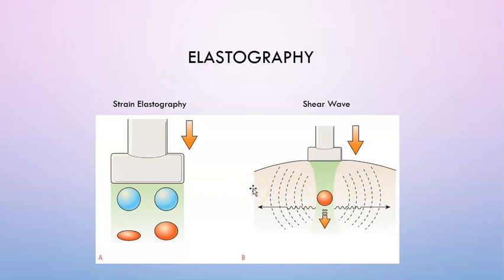Okay. Now, previously we've talked about how shear waves are generated in our physics class. We discussed that they cause fluid to move within cystic structures. But this is a diagram showing you exactly what a shear wave is. We have a pulse going straight down, and then to the side of it, moving laterally, is what we call the shear wave.